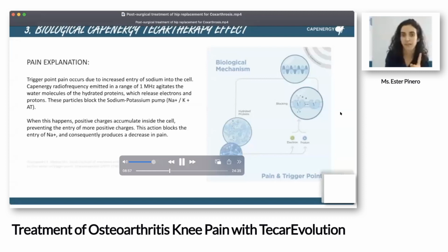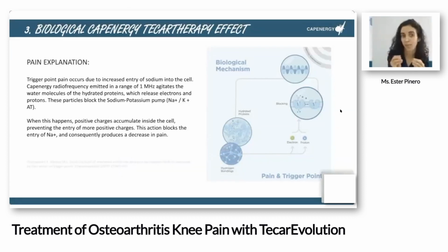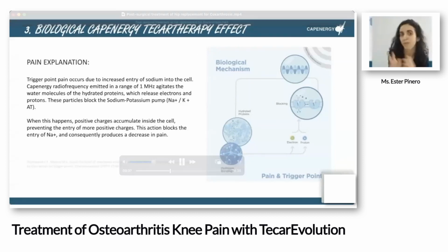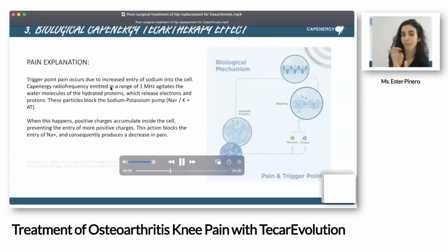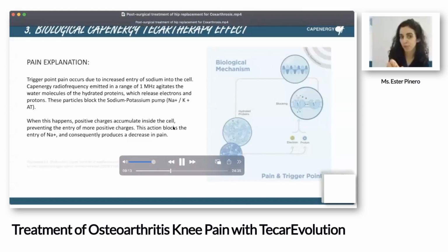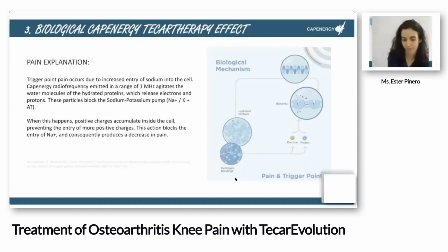One thing is that we reduce the pain of the trigger points thanks to the block of the entry of sodium, and also because we have a stimulation of the nervous system that reduces all this pain because we increase the endorphins we have.